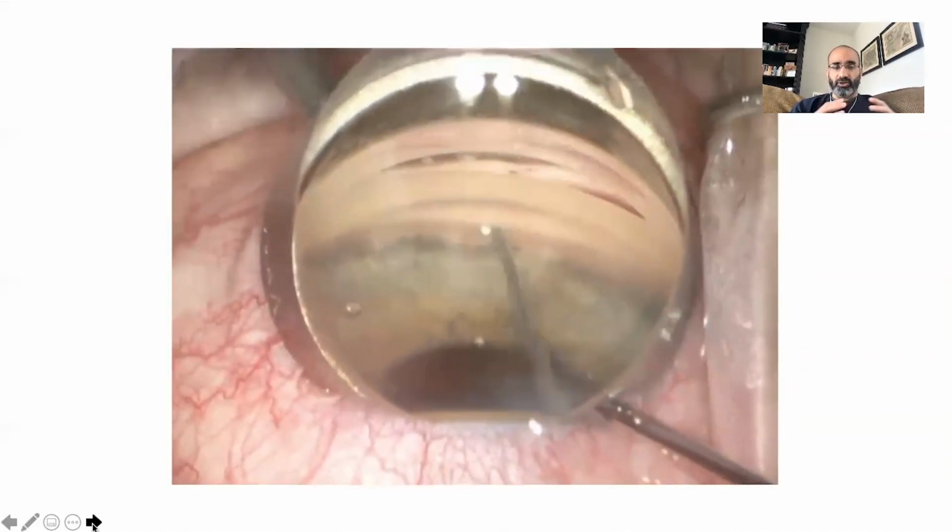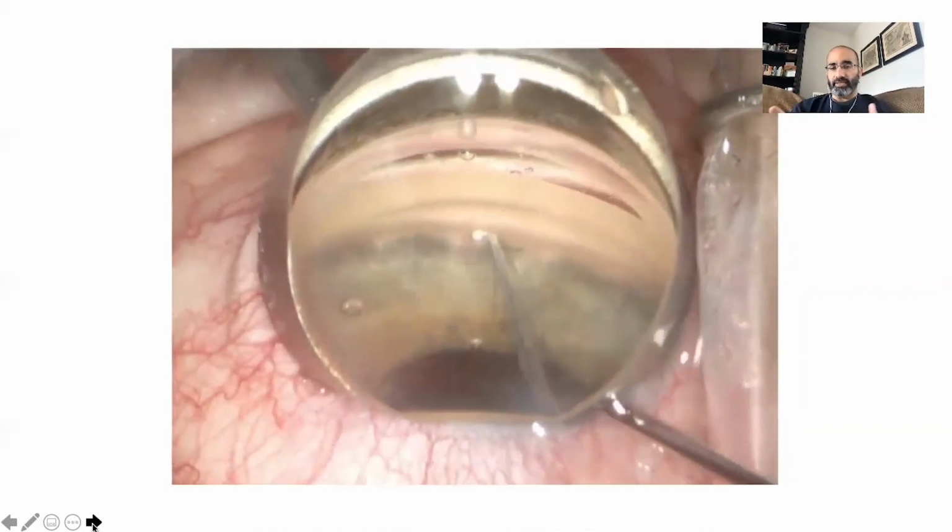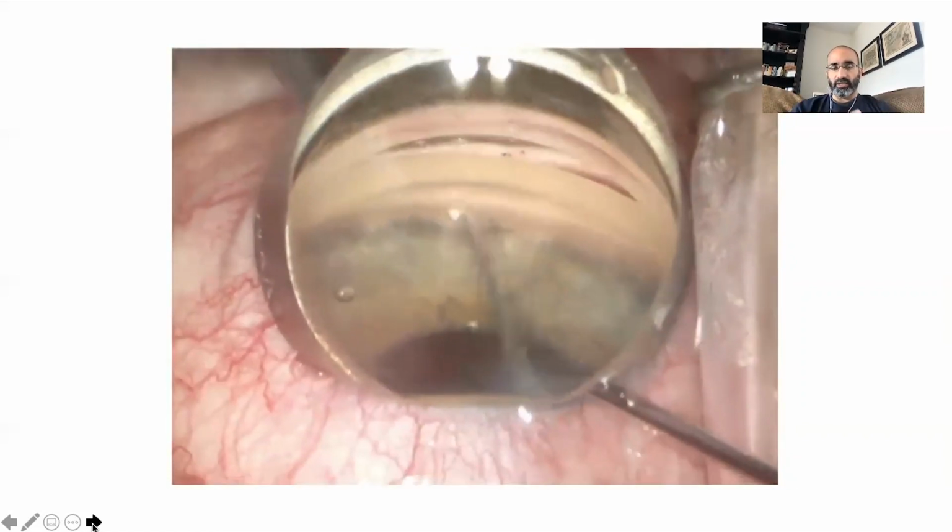At the end of cataract surgery, when you're just about to start getting into angle surgery, it would be really good to take 10 of your phaco cases at the end of the cataract surgery when all is said and done.